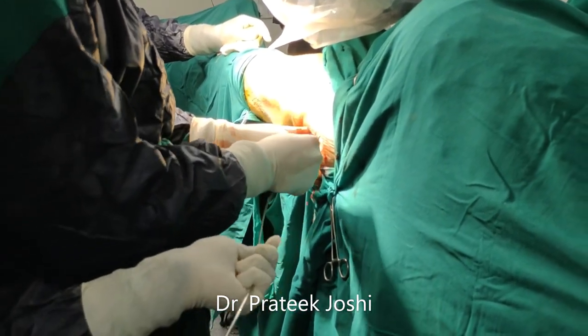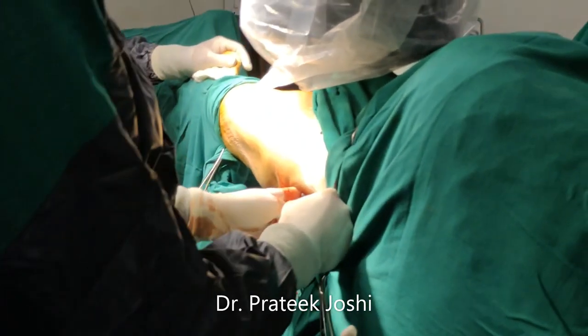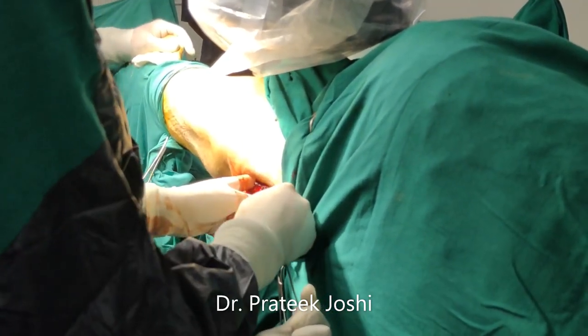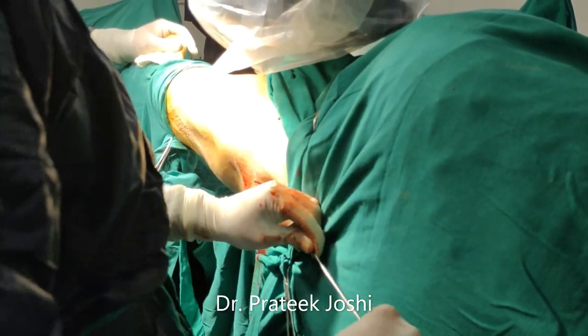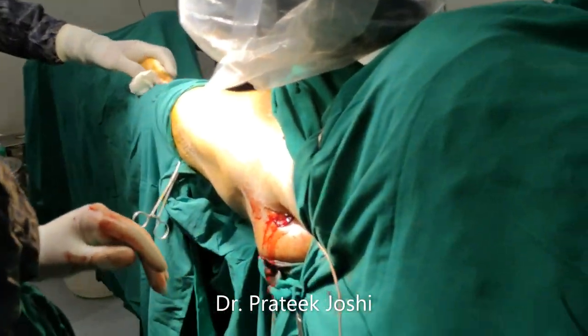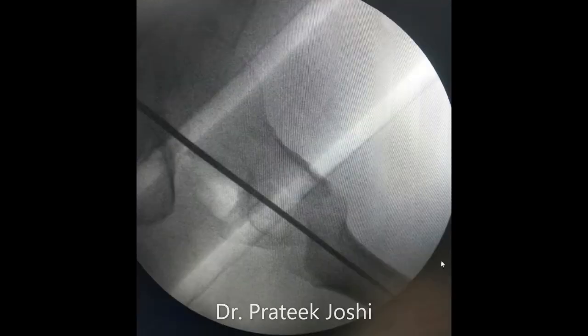Now we remove the awl and insert a guide wire through the track made by the awl and advance it till the level of distal femur. We confirm the ideal position of our guide wire in AP and lateral view before doing the entry reaming over the guide wire.